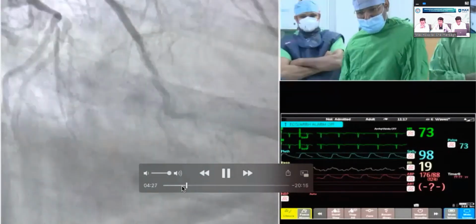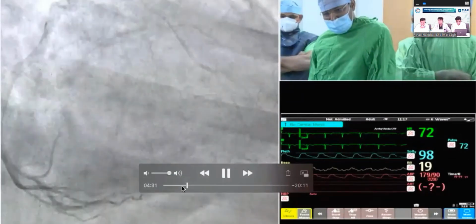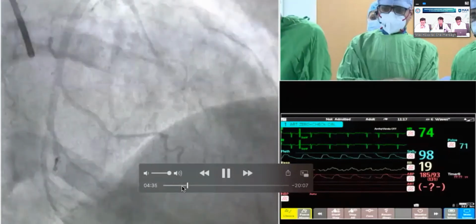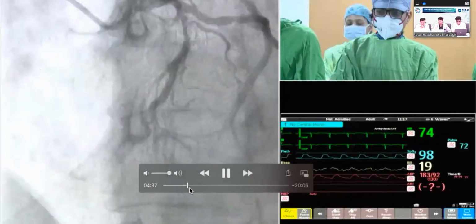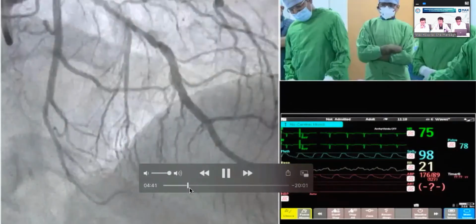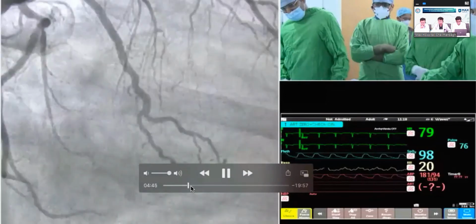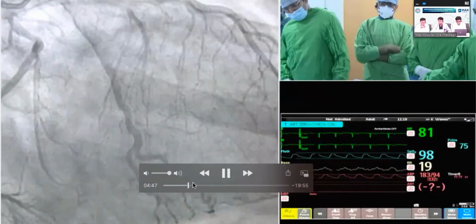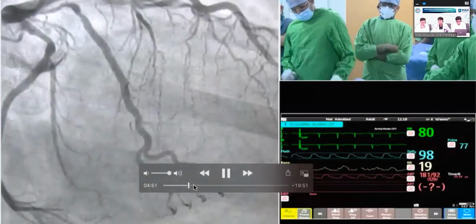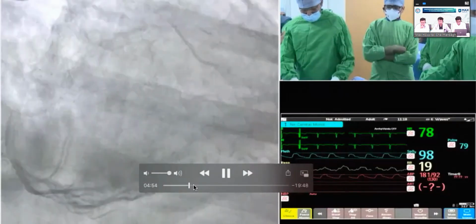See, the fluoroscopy image before the dye goes in shows the whole length of the lesion from the ostial LAD till the mid LAD, around 50 millimeter in length. The lesion is quite calcified and the calcium is quite significant. Passing a rota wire directly can prevent a step of microcatheter exchange, but this has a drawback: if the rota wire gets kinked or there is a minor bend, then it can lead to failure. So let's do an angiogram first.